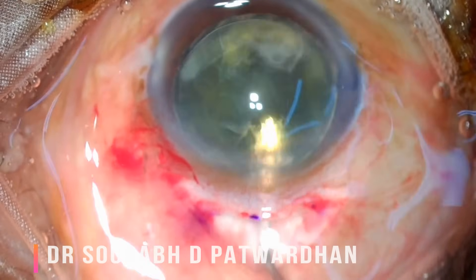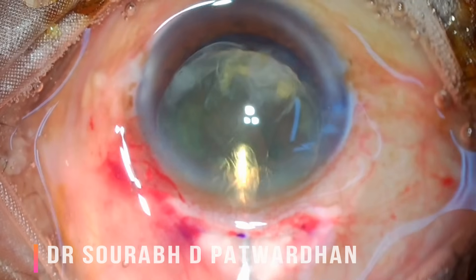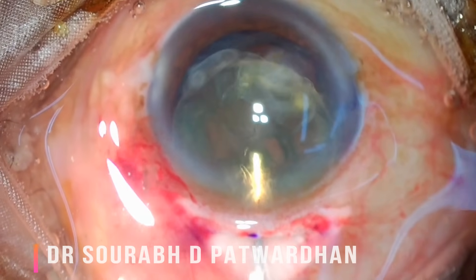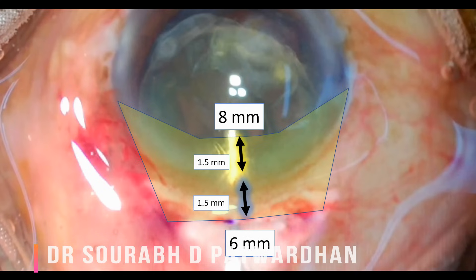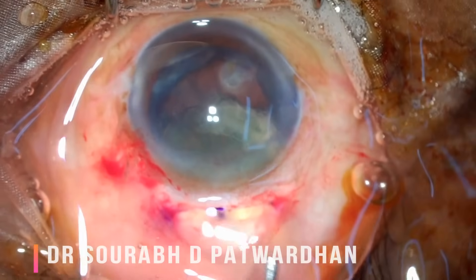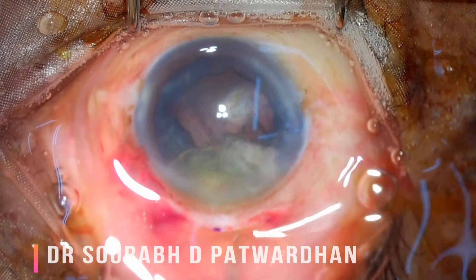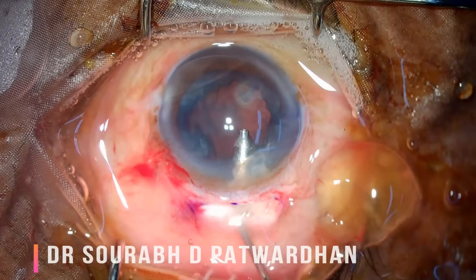I want to show this step in slow motion. Watch: I am pushing some visco under the nucleus and the nucleus gets engaged into the scleral tunnel — it is not over the iris but engaged in the tunnel. Carefully watch this step because this is where you can damage the endothelium. Imagine the scleral tunnel as shown earlier — the nucleus is engaged in it, and then it is simply a matter of pushing the posterior lip down for the nucleus to come out.